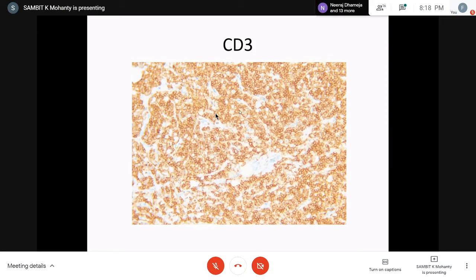I think there was a bone marrow following that. Okay, the bone marrow was negative. You can do it on this section as well. Okay, you mean the FISH on the tissue paraffin block? Yeah, definitely. It sometimes helps us.